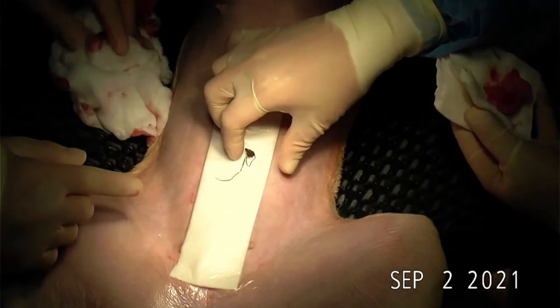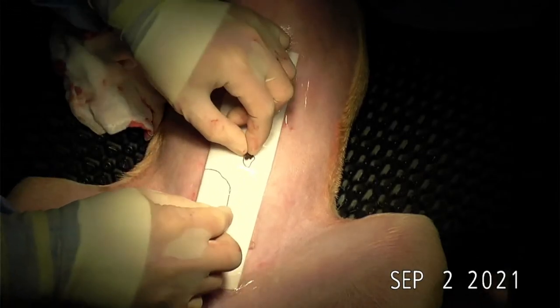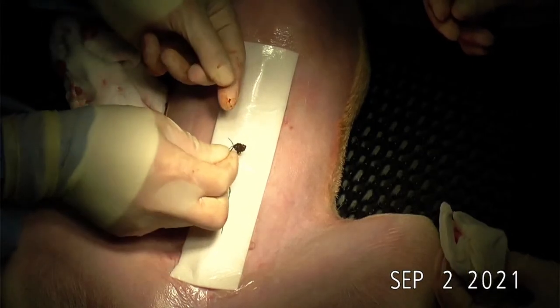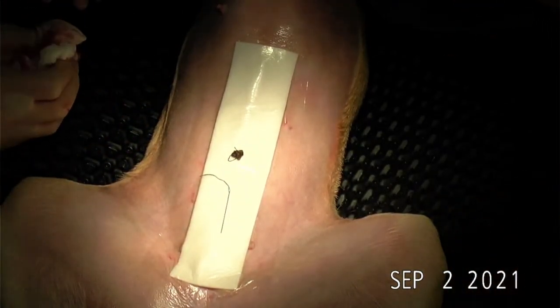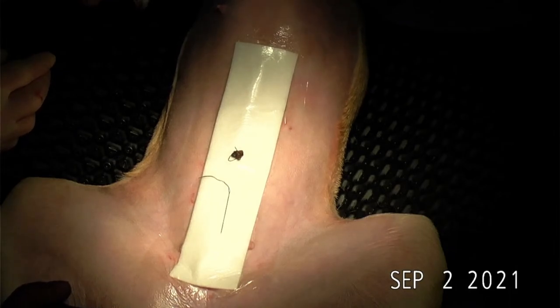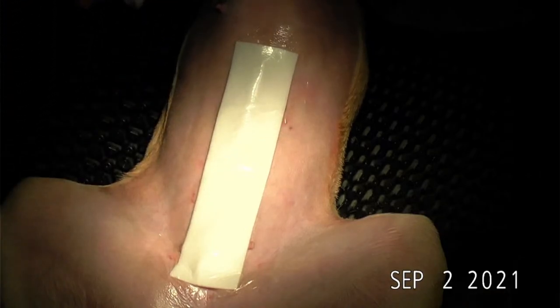Picture. This is the part of the needle and we cut it and thankfully the excess thread doesn't make tangles inside the intestine and we remove safely the foreign material, foreign object without any complication. Thank you and good night everyone.